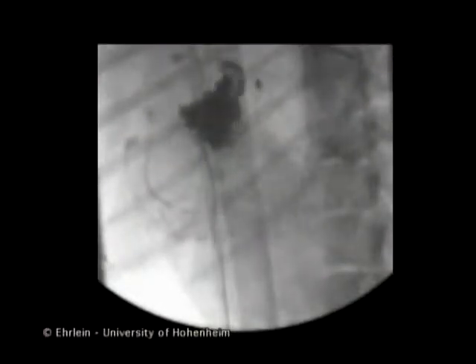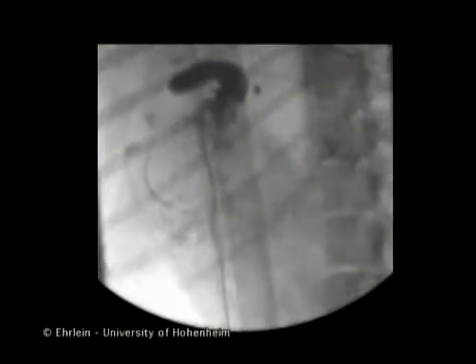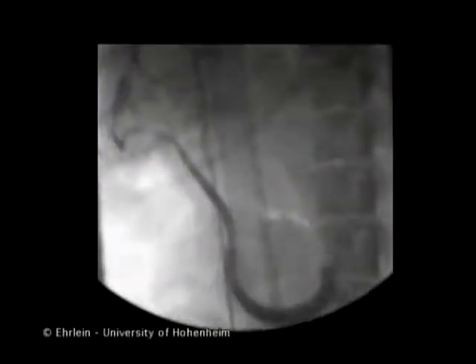A second contraction follows. While the first peristaltic wave fades out at the terminal antrum, the second wave forces the residues of gastric content across the pylorus into the duodenum. At this moment, the pylorus opens widely, the proximal duodenum is relaxed, and duodenal contractions cease. There is therefore perfect antral pyloric duodenal coordination during phase 3. The emptied contrast medium is rapidly propelled to the jejunum.